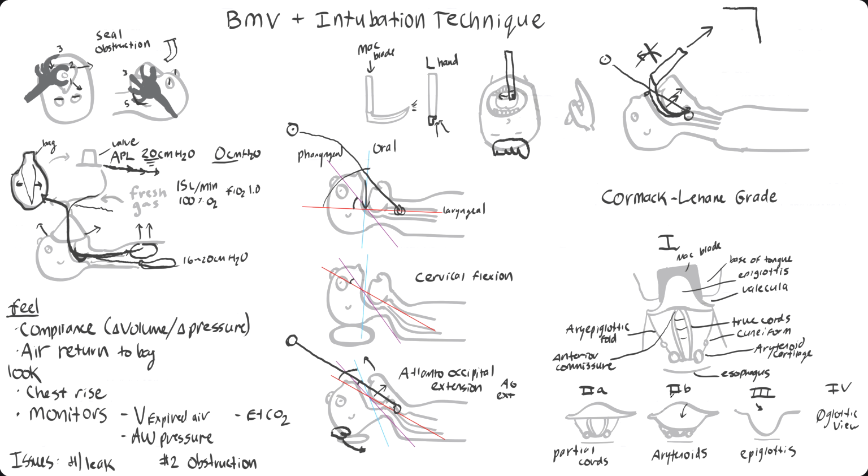We talked about making sure you're getting the blade tip inside the vallecula, but another maneuver you can do to help out is called BURP. This is backward, upward, rightward pressure. So before you grab your endotracheal tube from your assistant, you'll decide if you like your view or if instead you're going to manipulate the neck.